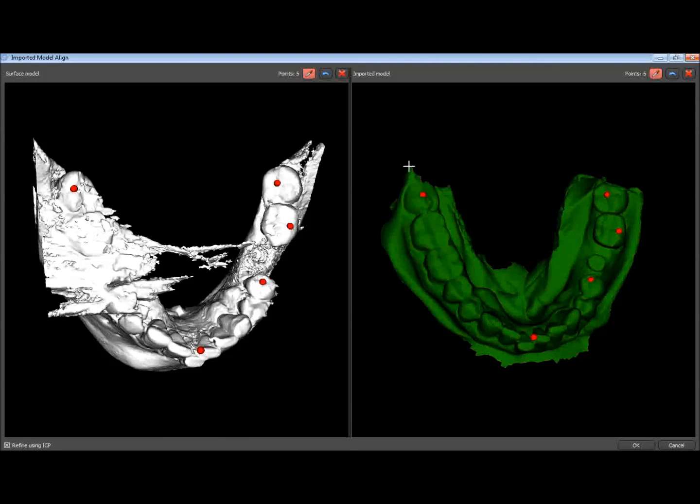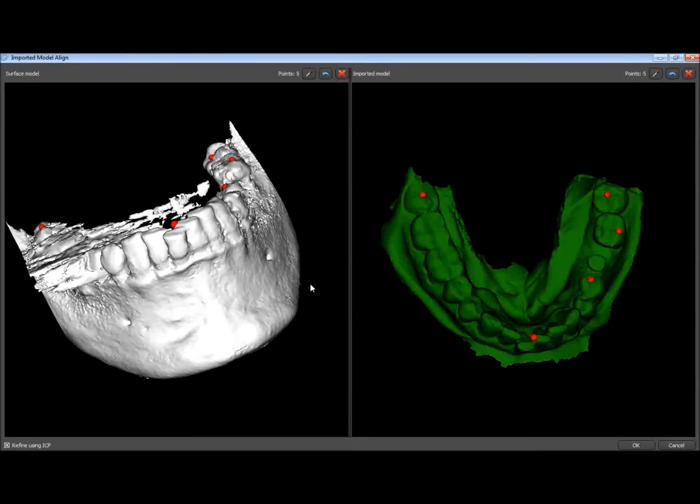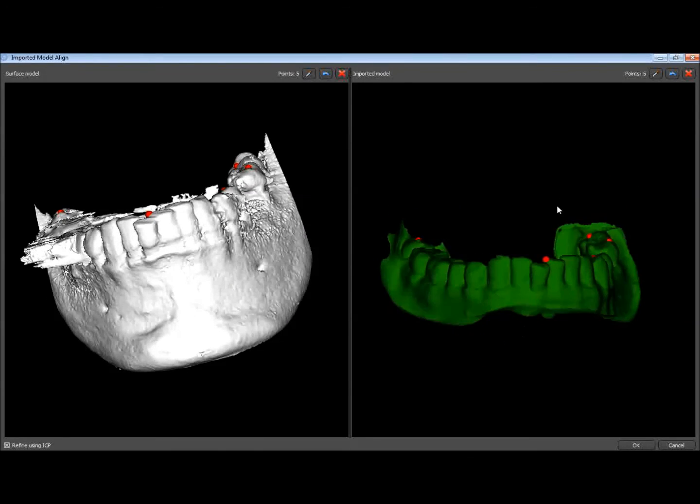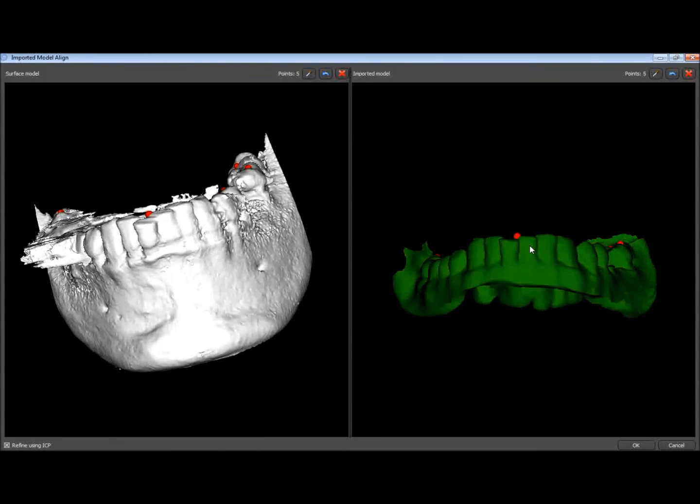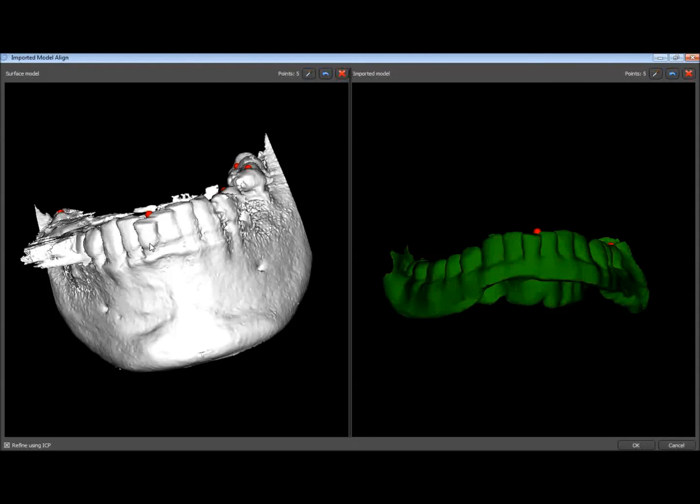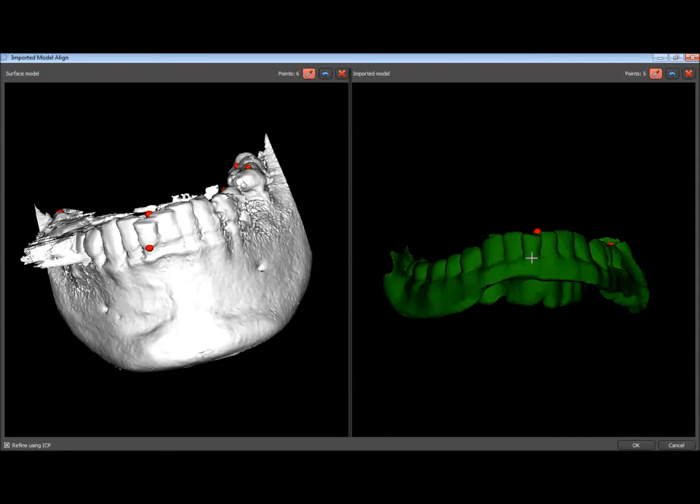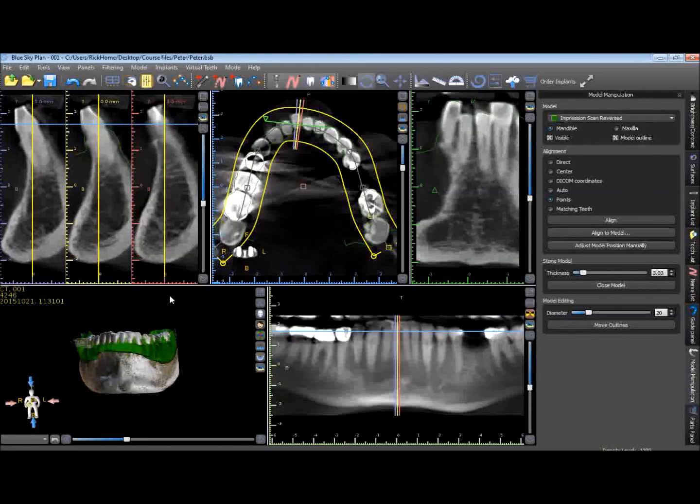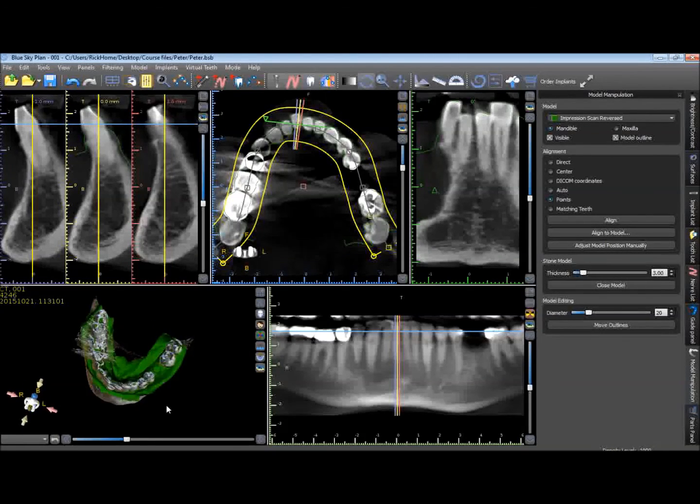That's the third molar. And then let's go ahead and rotate these images. And I'm going to pick one more point right on the central incisor that's kicked out here. Right at the gingival margin here mid-facial.